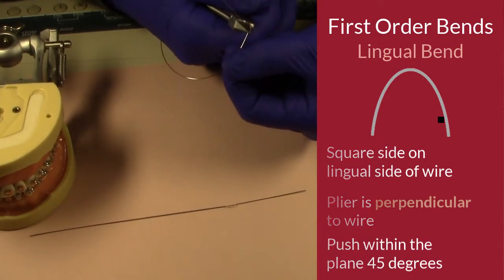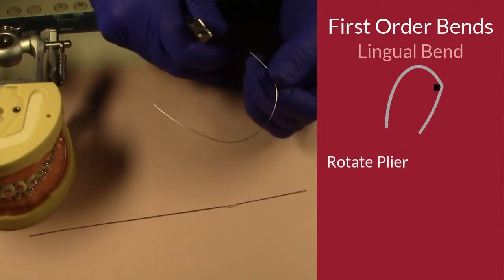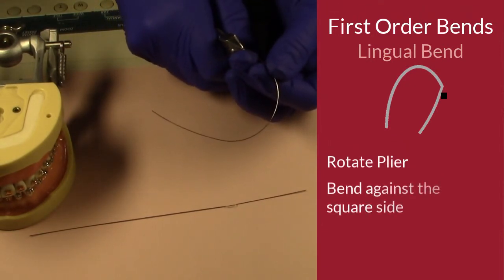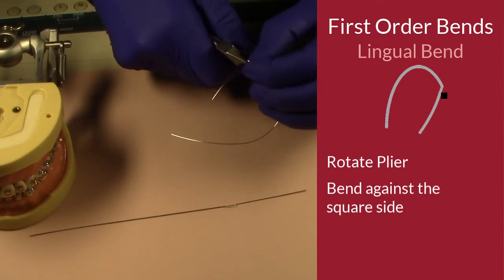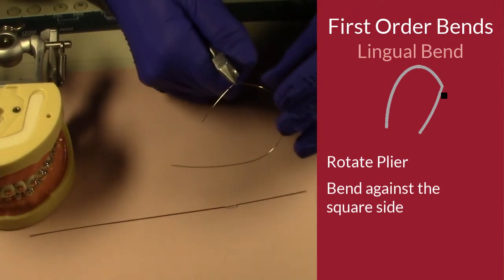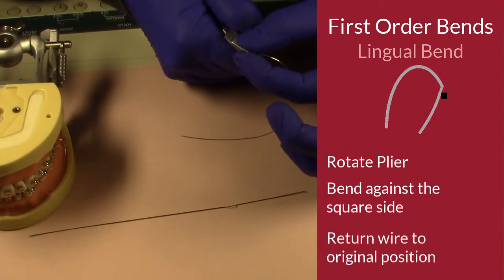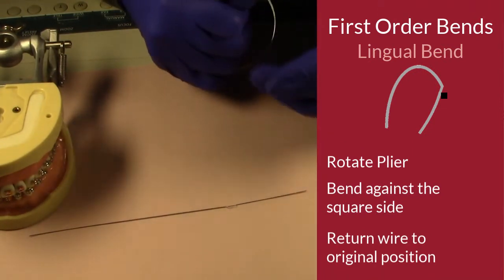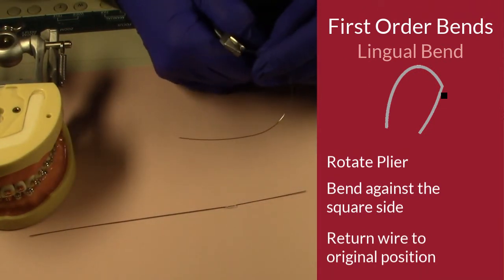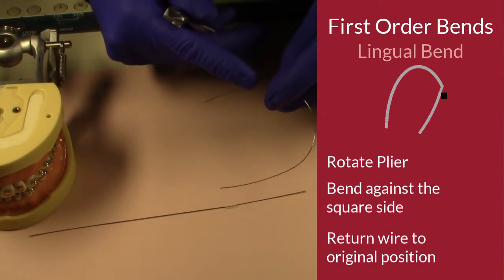Now I'm going to rotate this plier so I can create that table leg like I talked about at the beginning. And I'm going to put it just distal to that dot. And remember, I have to bend against the square part of the wire. So now I'm going to bring it back around. I'm going to bend this, and basically put the arch wire back how it was before.